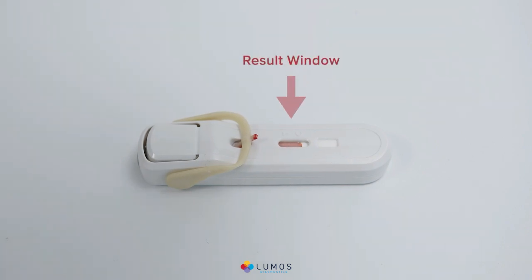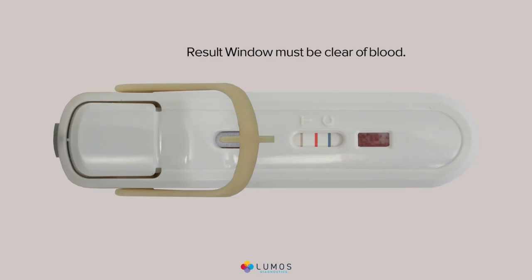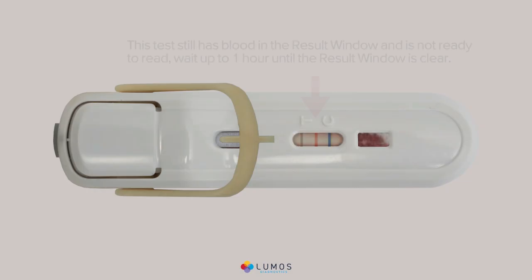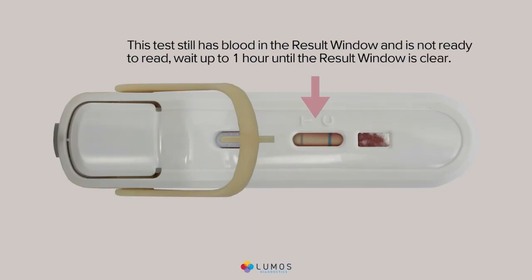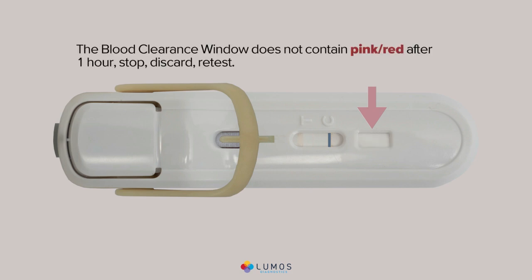Blood will continue to flow across the result window to the blood clearance window. Verify the test is ready for interpretation: the result window should be clear of blood. If the result window still has blood, wait up to one hour until it clears. The blood clearance window must contain pink-red. If it does not contain pink-red after one hour, stop, discard, and retest.